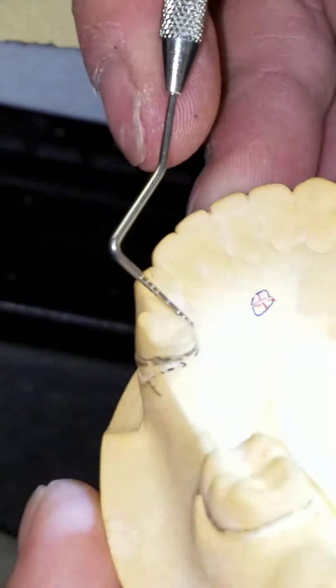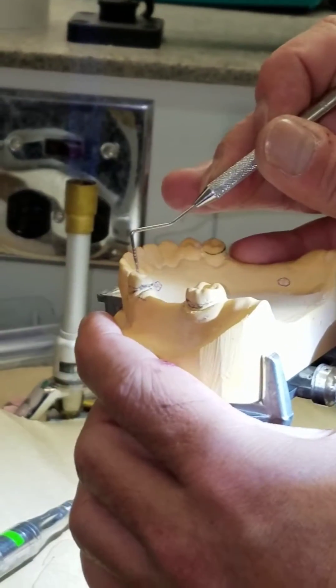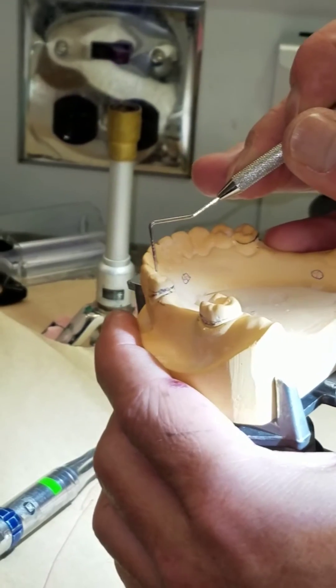There we go — line angle to line angle, no undercut. I'm looking at the undercut like this. My path of insertion: there shouldn't be a little lip up there that's creating an undercut.